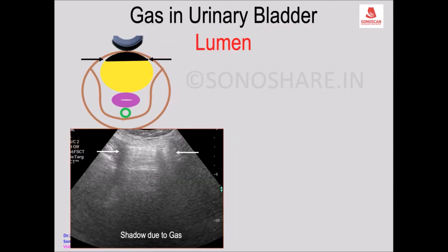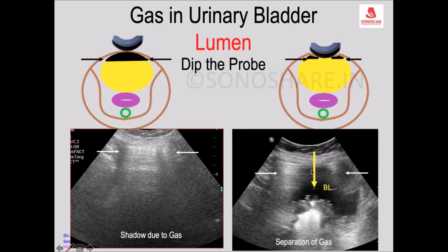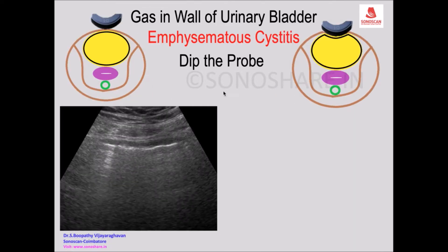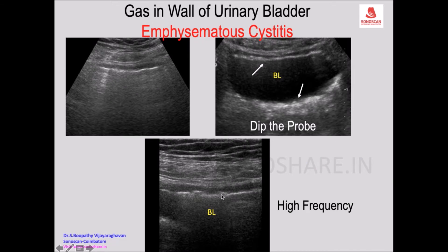A dirty shadow is seen, so this is the appearance. To confirm that there is gas within the lumen of the urinary bladder and not in the bowels or in the wall, the useful simple technique is to dip the probe. The shadowing from dipping causes the air to get separated, giving a fluid-filled gas appearance. When you dip the probe, if gas is in the lumen it will get displaced.